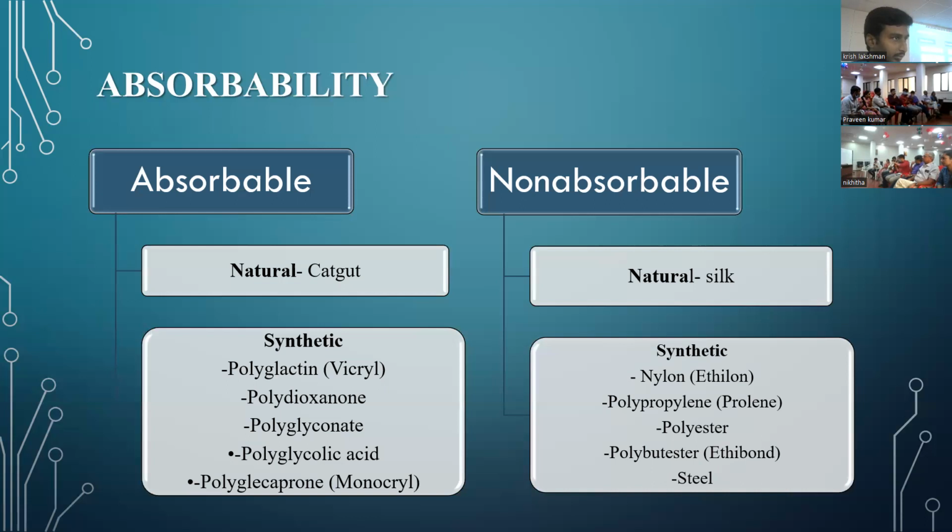Can you give me an example? I'm talking about internal. Give me an example. Pancreatic ducts. They will digest. No, I have not understood the point you're trying to make. Any area outside, inside the level of the skin, where you need sutures to be there for a long period of time. Correct. Dental, in orthopedics. What do we use? In laparotomy, where do we use now the fascial? Correct.